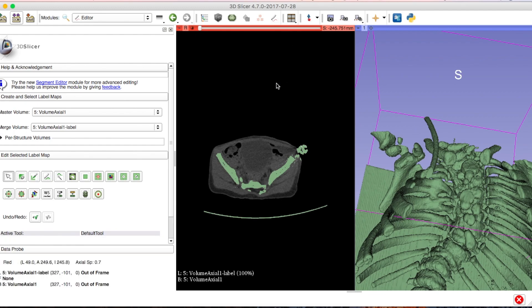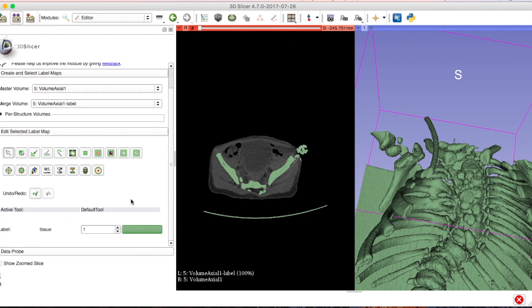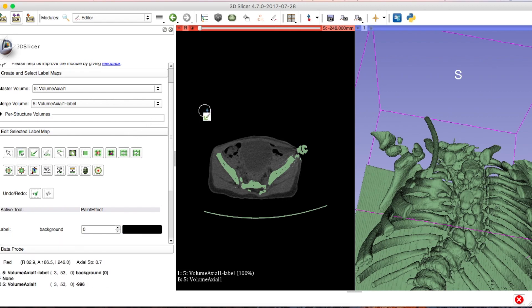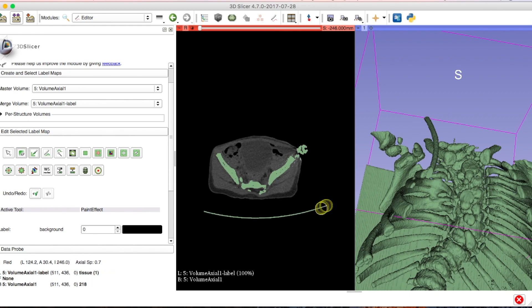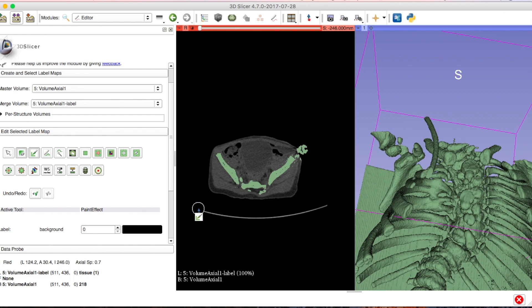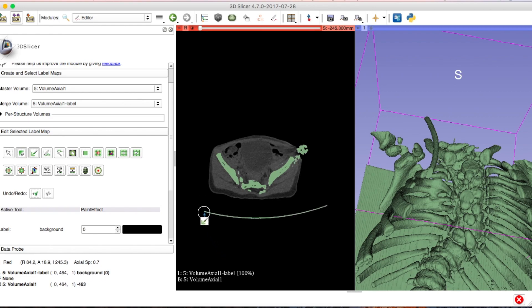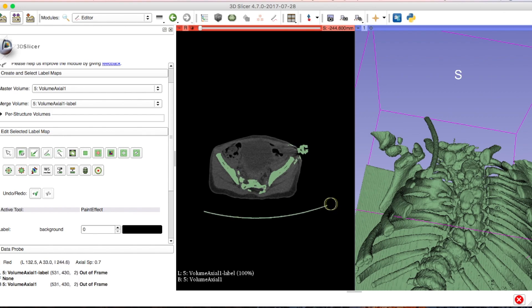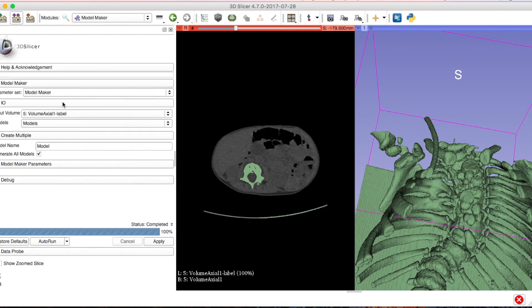Now I'll show you how to clean that up. Go back to the Editor tool, select the pen tool first and then the eraser tool to erase — or just the pen tool if that's all you need. The eraser is the third from the left on the top bar and the pen is the second from the left. I'll erase part of that green board in the back by going down and tracing through each slice.